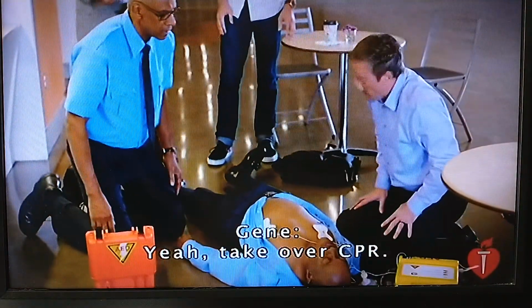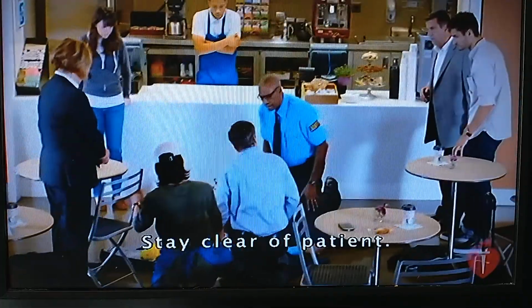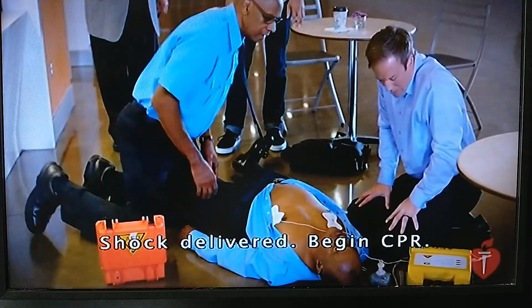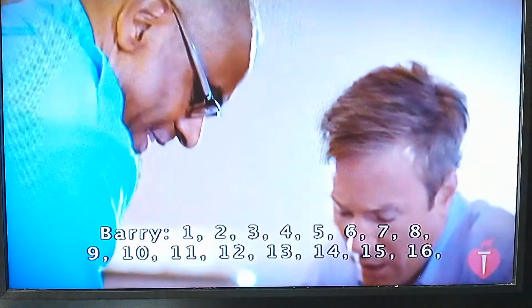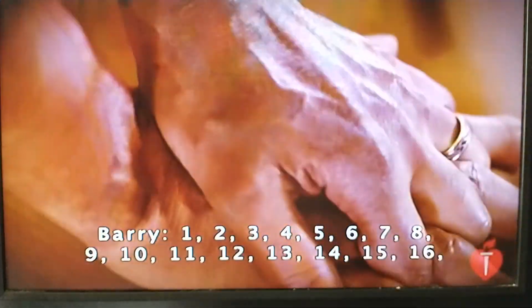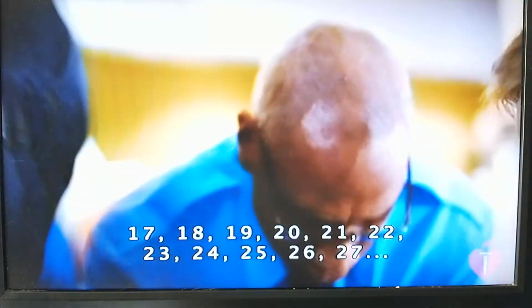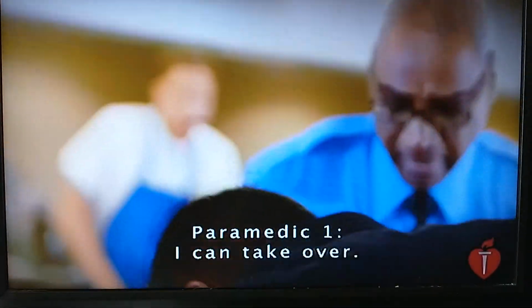Yeah, take over CPR. Shock advised. Charging. Stay clear of patient. Everybody stay clear. Deliver shock now. Shock delivered. Begin CPR. Start with compressions. 1, 2, 3, 4, 5, 6, 7, 8, 9, 10, 11, 12, 13, 14, 15, 16, 17, 18, 19, 20, 21, 22, 23, 24, 25, 26, Paramedics are here. Thank you. 29, 30. I can take over.